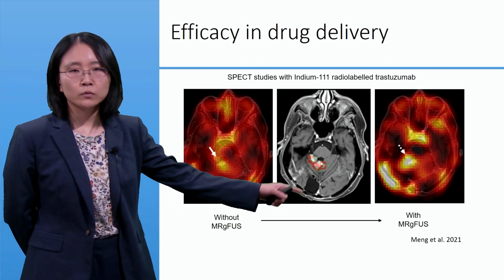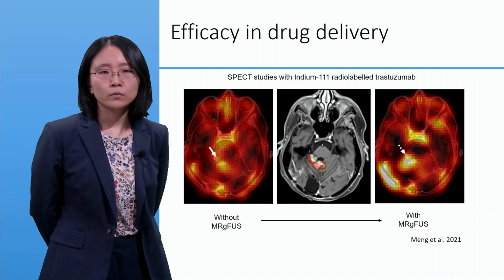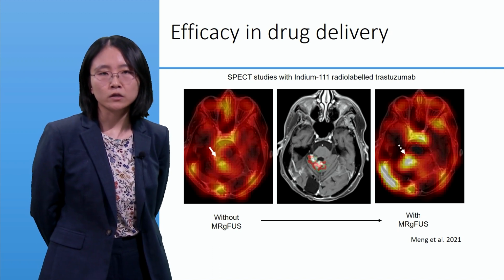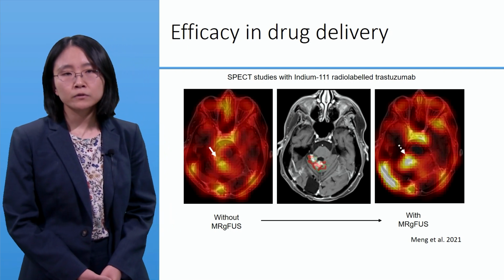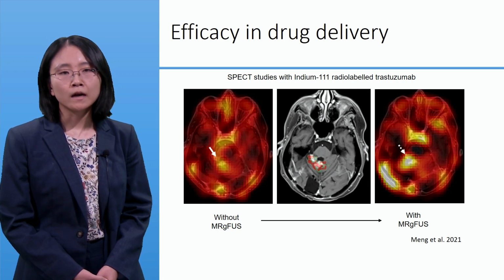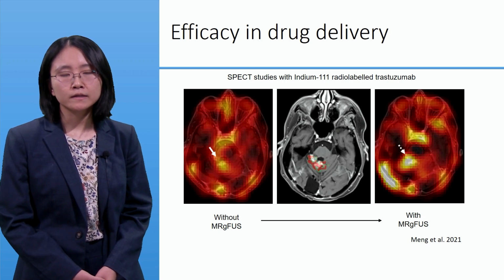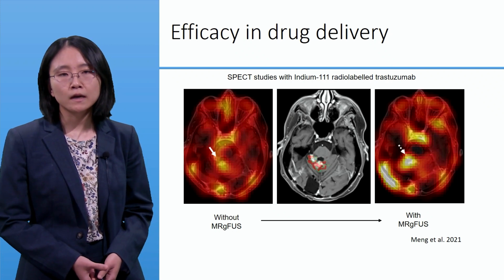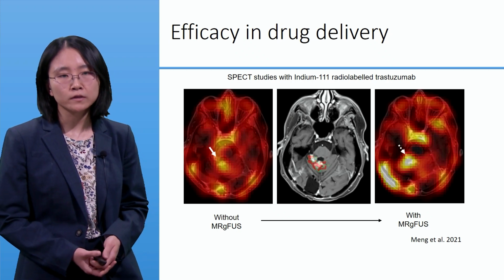However, after targeting with ultrasound, you can see the hot spot here is the area that we have targeted with ultrasound. We do see a significantly increased amount of drug uptake in the sonicated target. The conclusion of the study is that yes, focused ultrasound is able to significantly enhance drug delivery to the target. But again, how efficacious it is is a question that needs to continue to be pursued in future studies, and will greatly vary depending on the tissue property itself as well as the drug of interest.